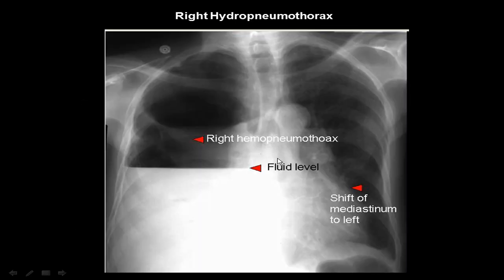There is another pathology: a combination of both air and fluid in the pleural space, which we call hydropneumothorax. Hydropneumothorax has a fluid level differentiating the air above and the fluid below — like this case of right hydropneumothorax with a fluid level and shifting of the mediastinum to the left.